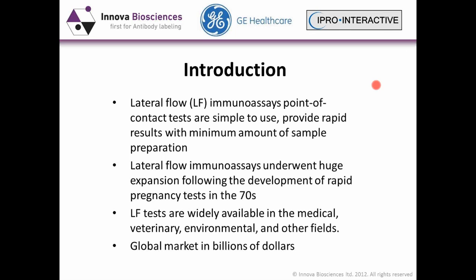I'll start my talk now with the introduction. Lateral flow assay development is driven mainly by the need to move some diagnostic immunoassays from the laboratory setting to a point of contact or point of care setting.